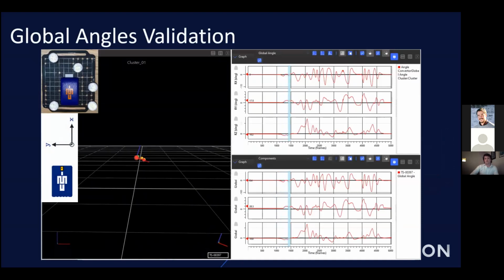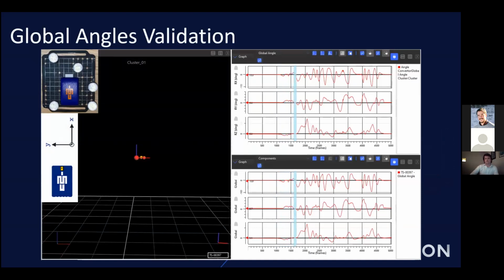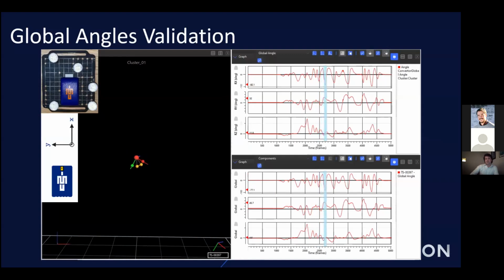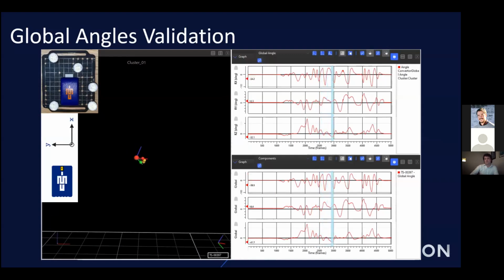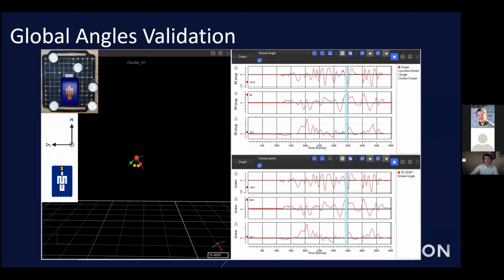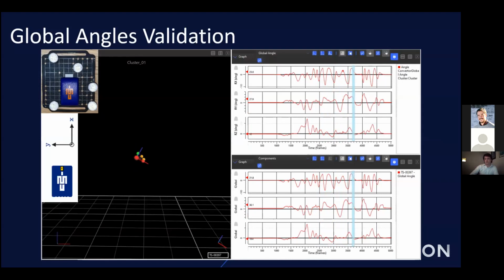So next we come on to the question of IMU Global Angles. The question is usually, how accurate are they, or how do we validate them? Again, there are many ways that this can be done. So here's just an easy example, which hopefully you'll also be able to do if you are using an optical motion tracking system as well.